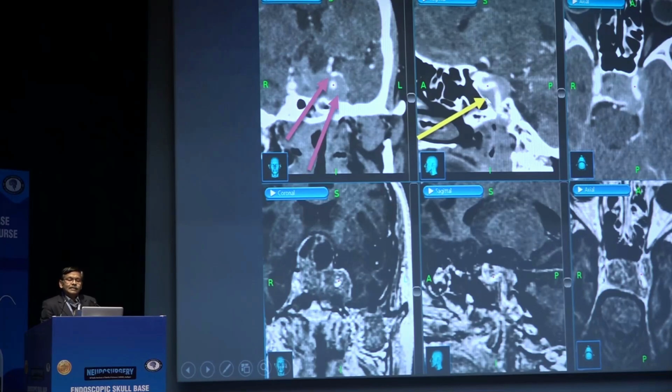So in this area, there is so much of tumor. I think Dr. Prakash also had highlighted. This is a very safe area. So here, there is so much space, so you can confidently cut the dura across the carotid artery. But here, the tumor is also not there and the space is also very limited. There is no need, as well as we should not open the dura here because this will be risky. But here you can be more confident.